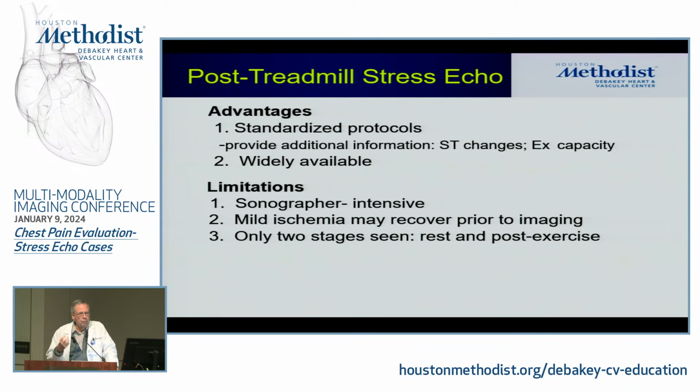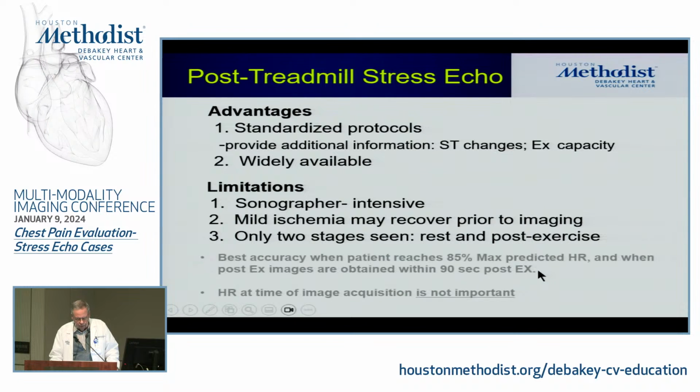And even with the best techniques, at times we end up with a post-exercise image that is not exactly the same as the resting one. And then we have to decide how to manage that when we are evaluating the patient.